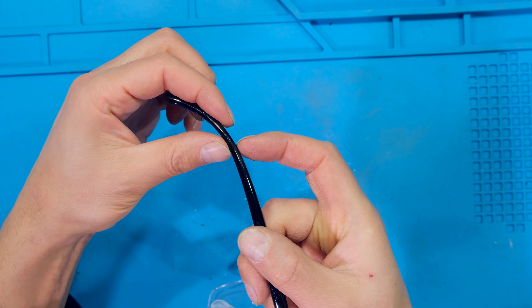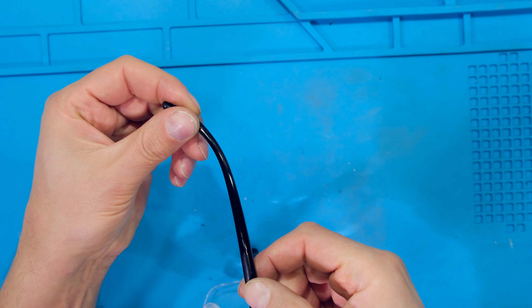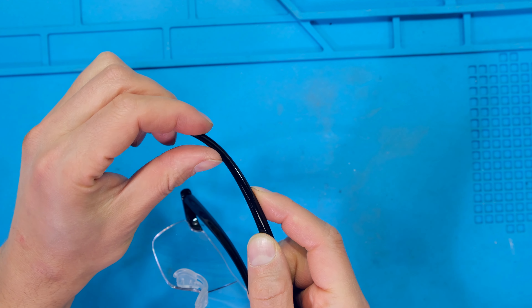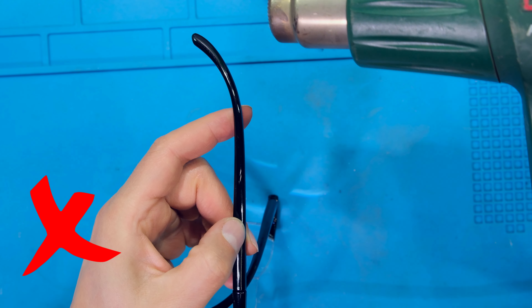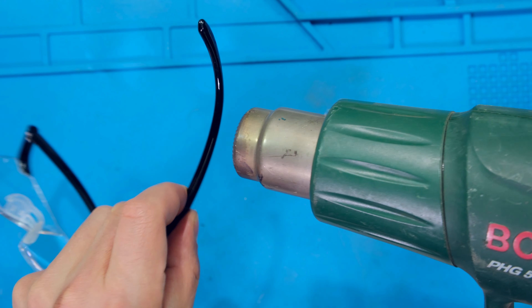Just a couple of tips. If I just need to bend this temple a little bit down I don't need to heat up the whole temple — I just need to heat up that area, but I also have to heat up on the side so that when I bend it it doesn't tear. There's no need to heat up the whole temple; I just need to heat up the section that I'm busy with.